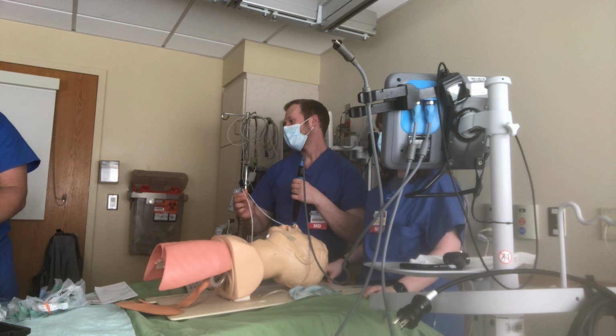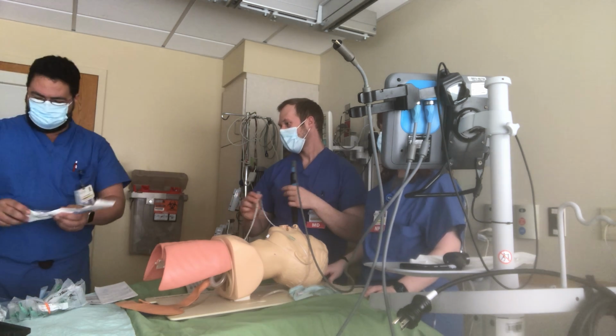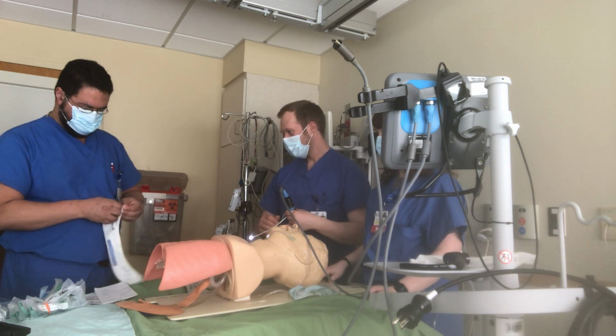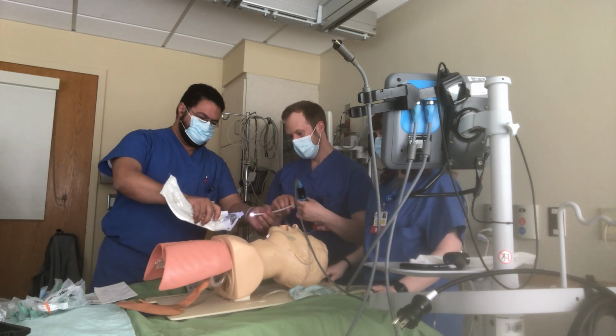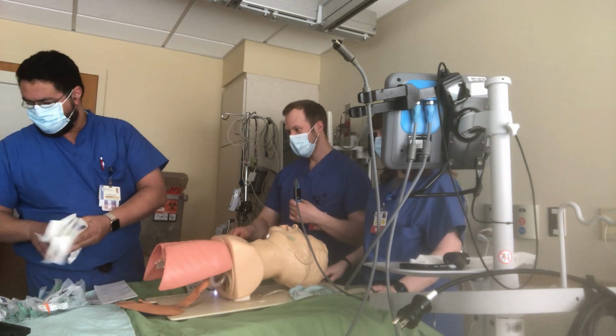So for the ET tube we'll choose a small one. Let's say we have this on. This is a big one because I don't have a lot of them.